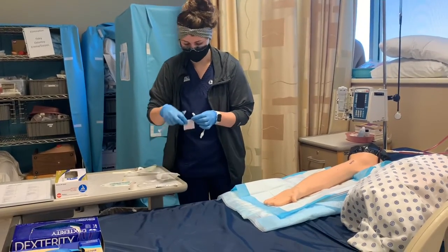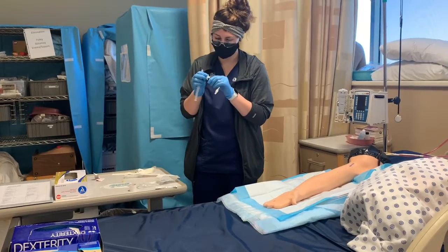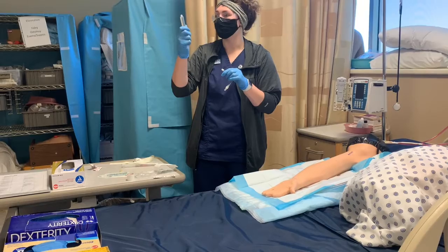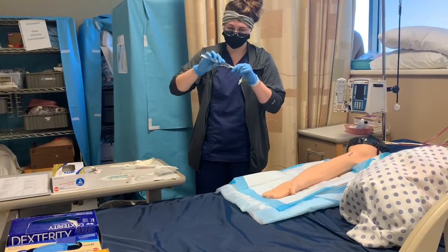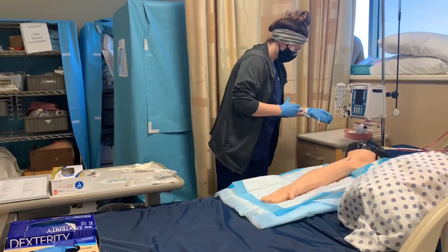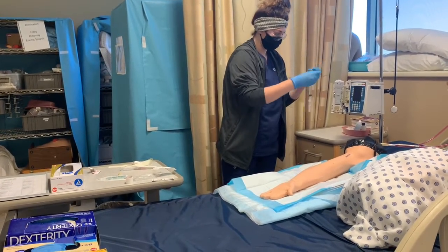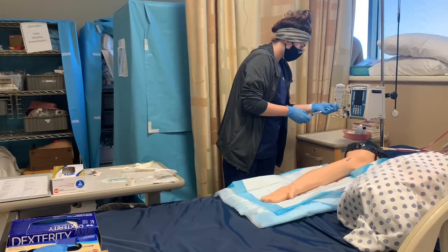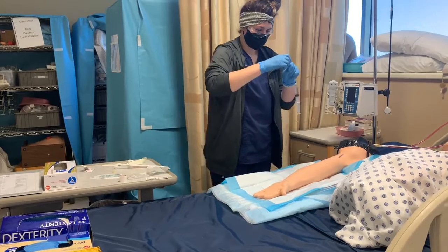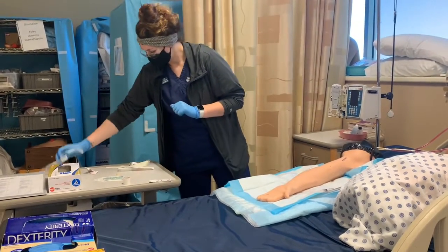So I'm going to clean this off just to make sure. Make sure there's no air in there. I'm going to prime my line. Set that here for when I'm ready. Okay.